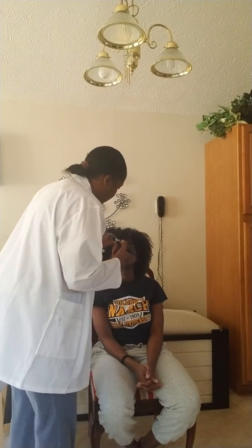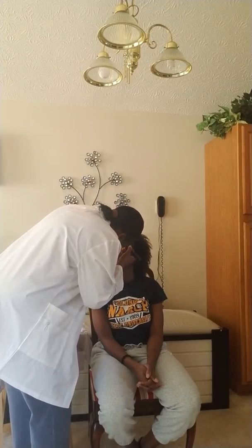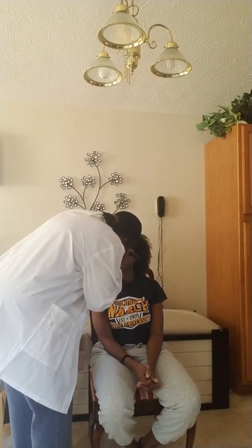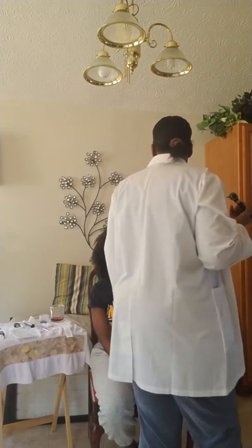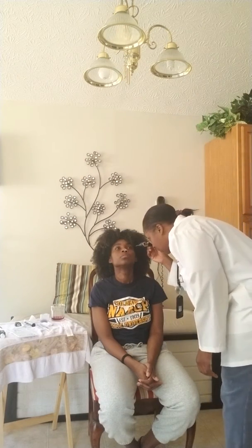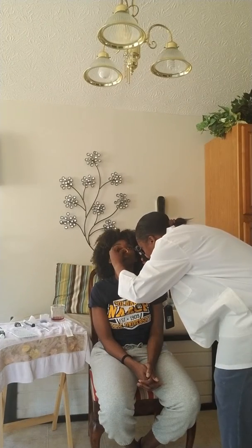Can you tip your head back a little bit for me? And you can lift up on the nose if you need a better vision, and also always protect your patient. We're not going to go too far in because she's already tender. She is a little red in that side. And it should be a nice pale pink color. She's a little bit more red than it probably should be. Now I'm going to be really careful with this one because this is the one that she says bothers her.